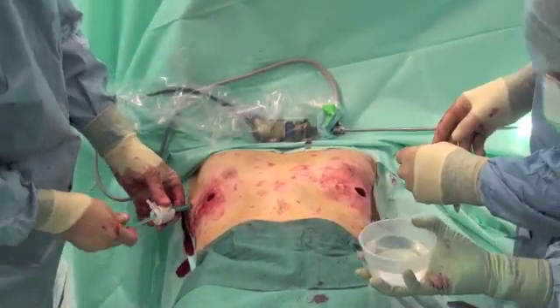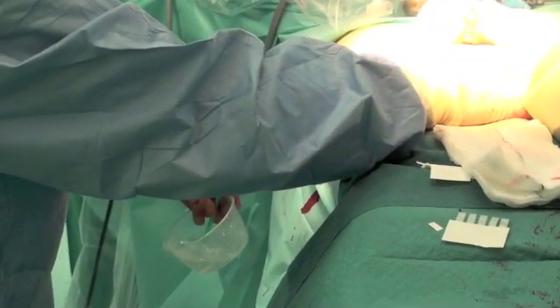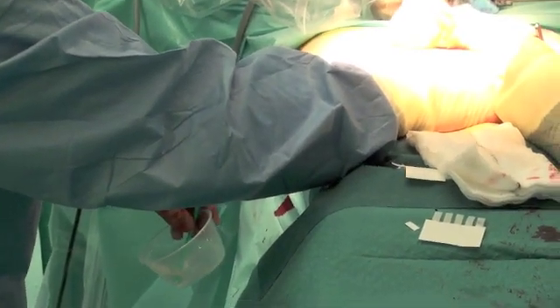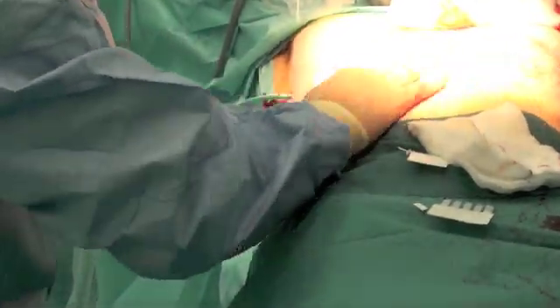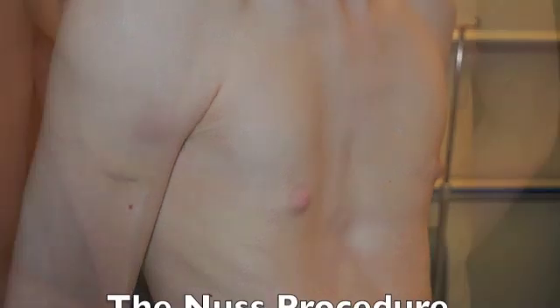We don't leave any drains in the chest. We just place this 16 French Redevac drain temporarily. We inflate with five of PEEP by the anaesthetist, pressing on the chest — we actually do this for about five minutes. When nothing else bubbles out, we just take the drain out. There are very low instances of pneumothoraces. And that's it — thank you very much for watching.